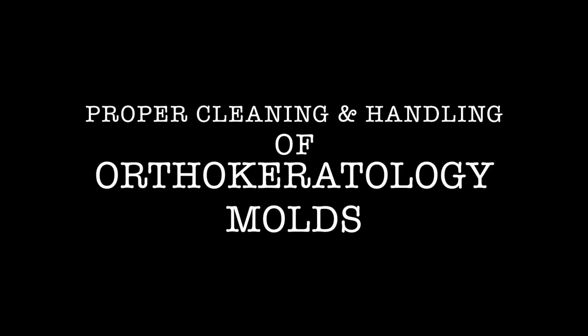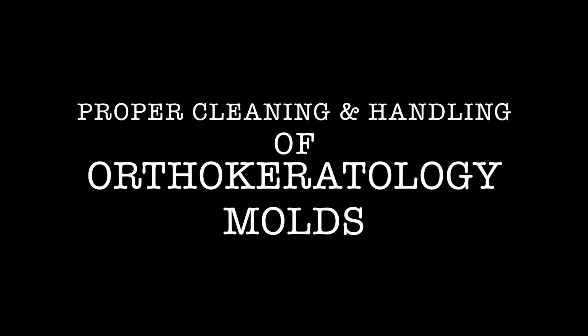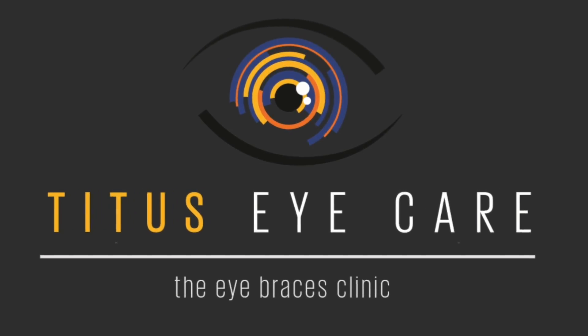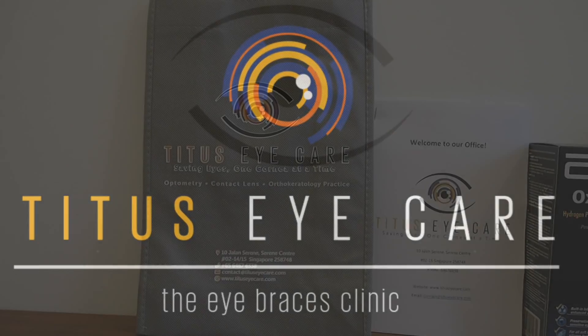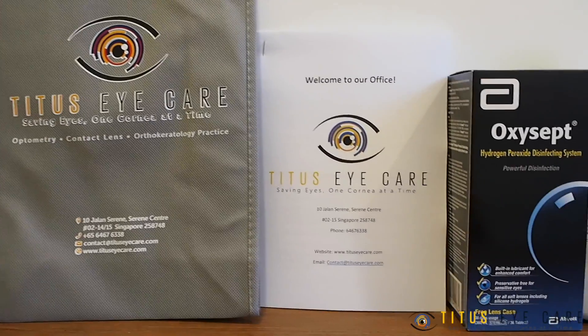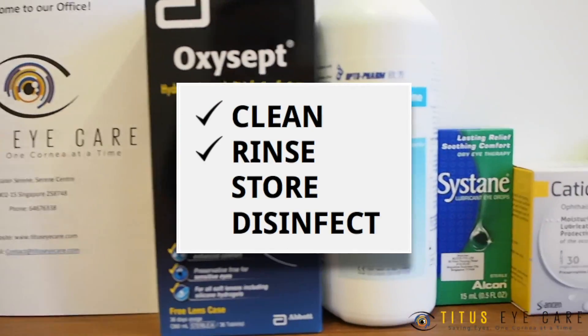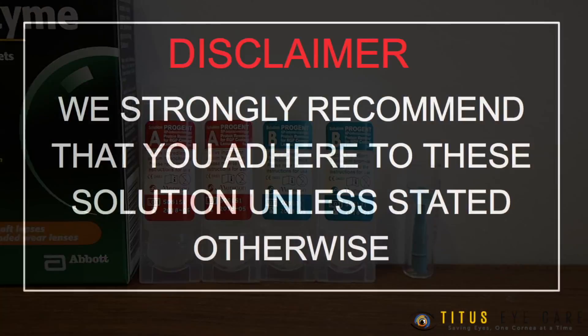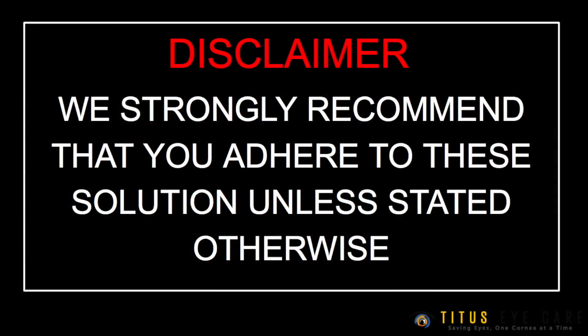This video is a tutorial on the proper cleaning and handling of your ortho keratology molds, brought to you by Titus Eye Care, the eye braces clinic. All the solutions prescribed are used to clean, rinse, store and disinfect your ortho keratology molds. We strongly recommend that you use these solutions unless otherwise stated.